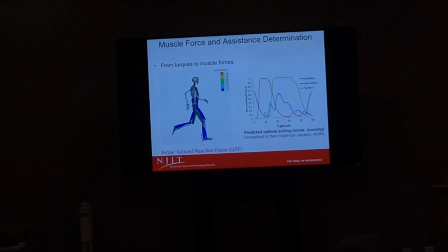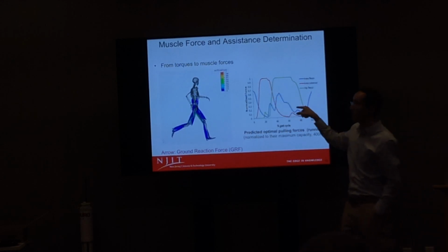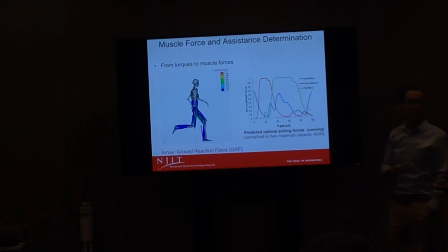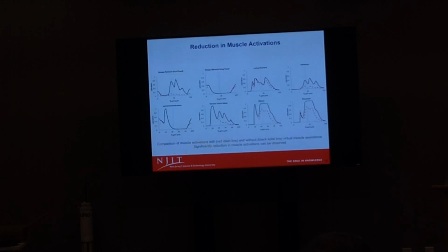Basically, the model can help you optimize some of the actuations. Of course, this one is a motion we tracked, but hopefully you can do parametric simulations, or have some kind of profile that you analyze into a certain spline curve, or you can optimize those profiles as well. From that we can see how much reduction there is in the real muscle actuation. You can see it's a pretty big reduction.